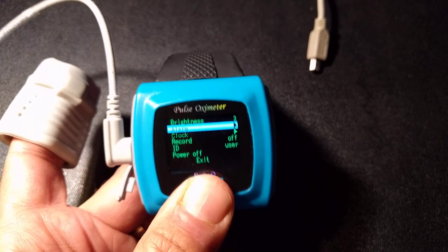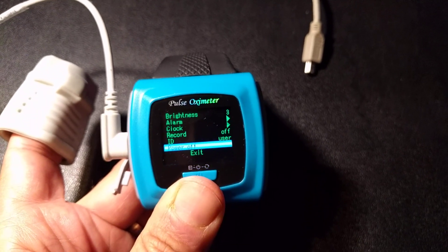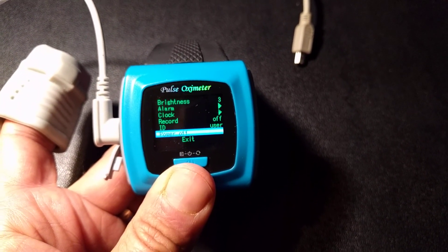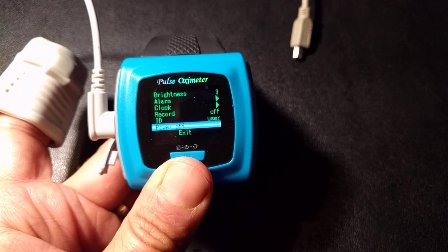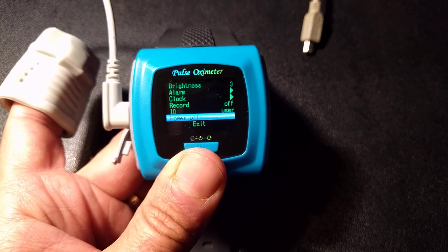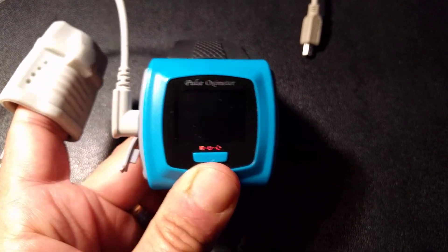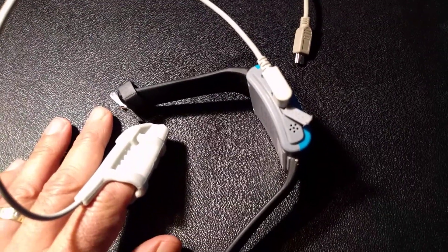When you're all done, go down to exit here, or power off anyway, and power off the device. Make sure the recorder is off — that way your data is actually saved, otherwise it won't be good. I want to be able to read and interpret your data. Go down to power off after you're sure that you're done recording and your data is saved, then long press. Long press power off. You see the thank you. Put everything back including the USB cable and ship it to me, and I'll interpret it for you. Good luck.